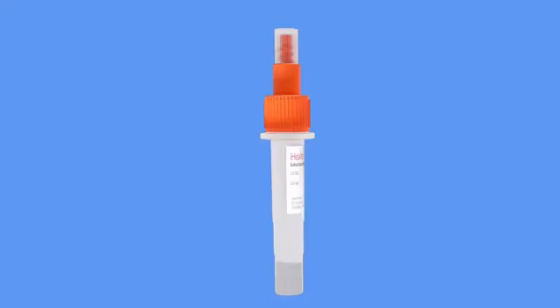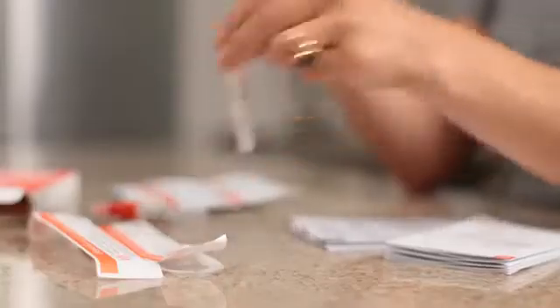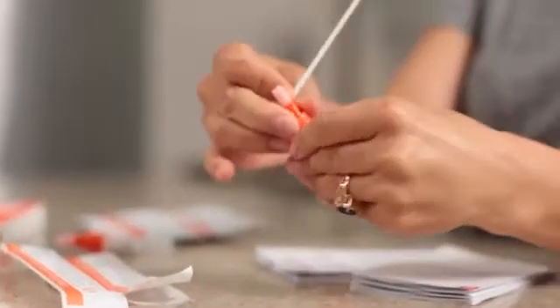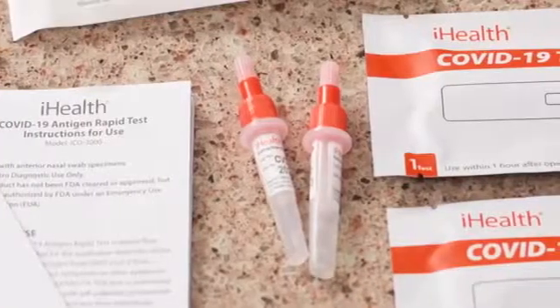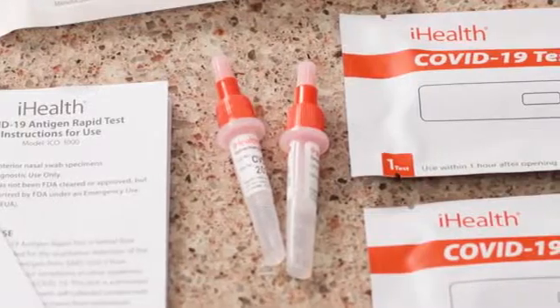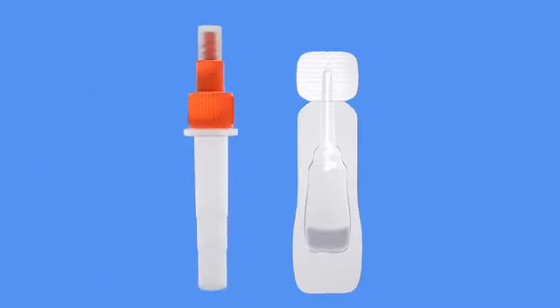If your tube already has liquid inside, you can skip this next part, but go ahead and tap your test tube 3 or 4 times against the table just to shake up the solution and get it ready for the test. Your test tube will likely have the testing solution already inside, but in some cases, you may have received the solution in a separate packet. If so, no problem. It will look like this, and we need to pour it into the test tube before we start the test. Let's do that now.